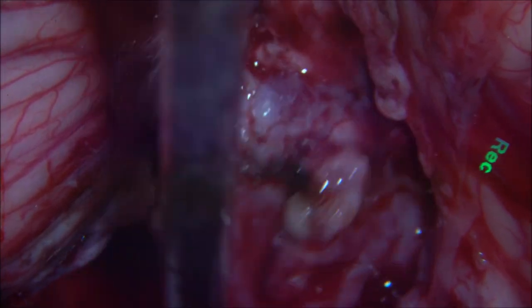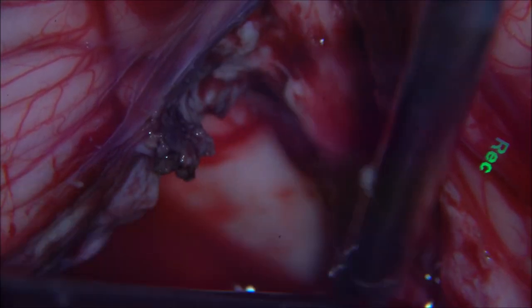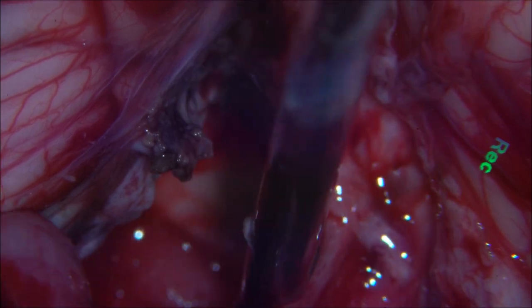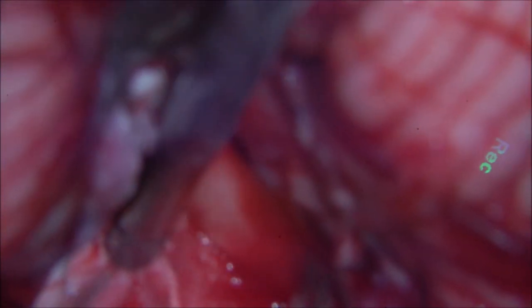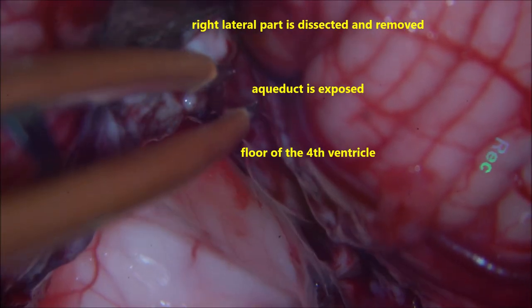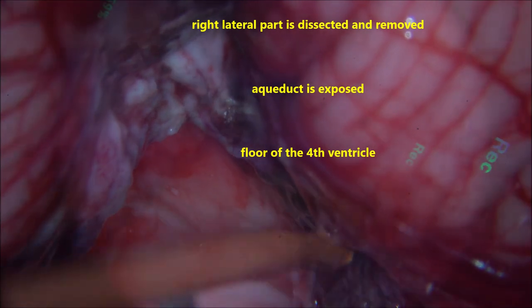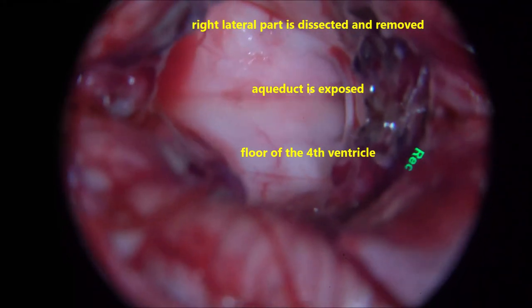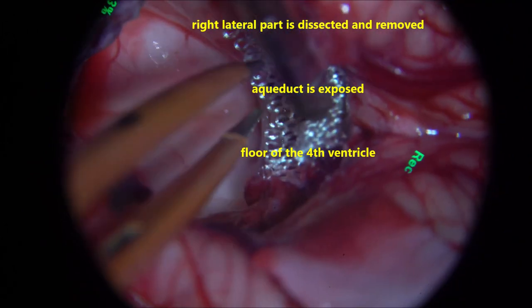We ensure the aqueduct is always covered with wet cotton until complete resection is done and bleeding has stopped. The inferior and right lateral part of the tumour is dissected, separated, and taken out. You can see the floor of the fourth ventricle very well — the middle cerebellar peduncle and inferior cerebellar peduncle. The tumour is attached there — that is coagulated and a small raw area of the tumour is excised. The whole floor of the fourth ventricle is now visible completely. The aqueduct is opening there — suction is applied and blood is cleared.